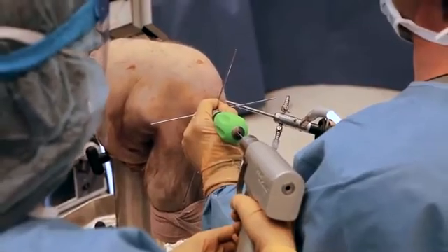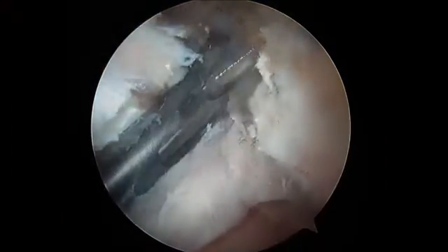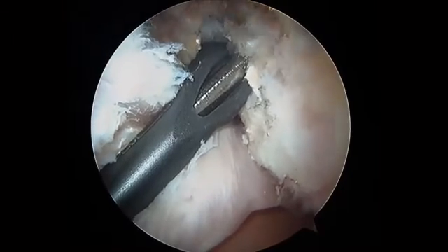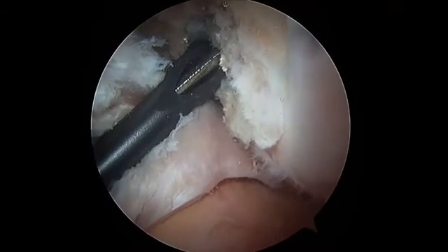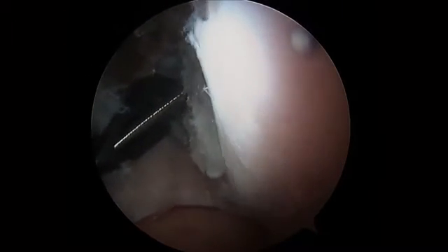Got a flexible guide wire that's coming in. Okay. And bullseye. So now you get a sense that we're in this equidistant position. We're about halfway between the top of the notch and the bottom of the notch, or the most posterior aspect of the lateral femoral condyle. You can also notice that our guide wire is exiting halfway between the anterior aspect of the femur and the direct lateral aspect of the femur. So it's an anterior lateral exit point.